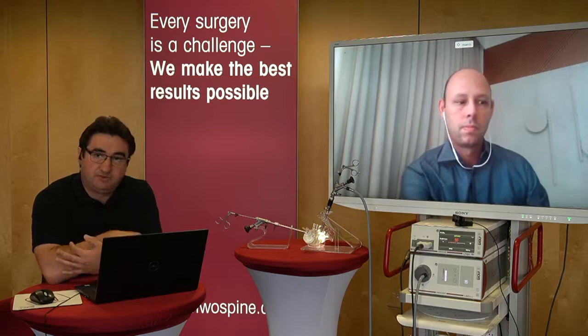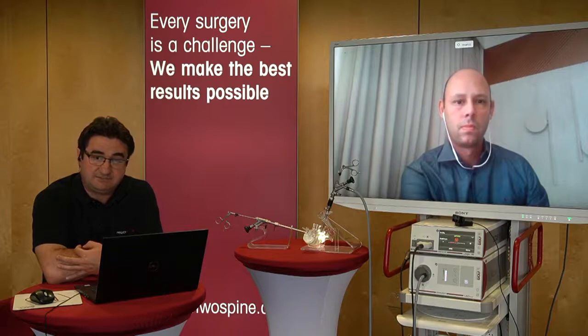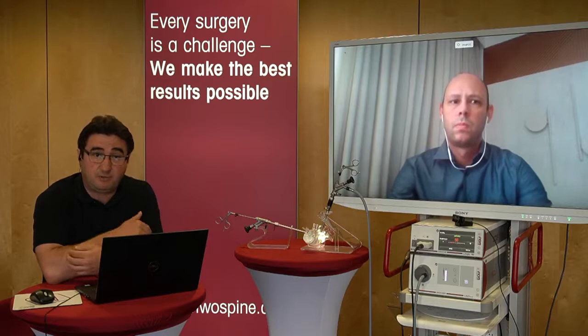But the stenosis system is really good and aggressive for faster bone resection, especially if you are working with central canal stenosis and need to do only posterior decompression. Then it's better to use the stenosis system. It's really fast and you can do it easily.